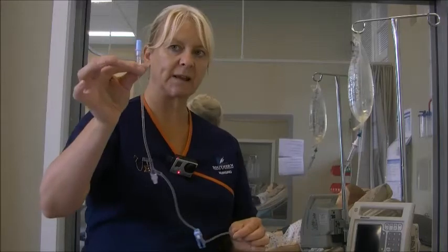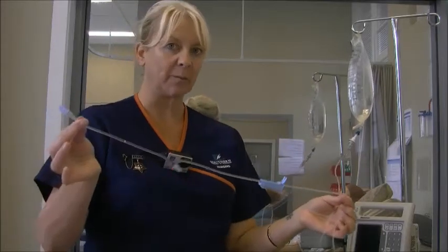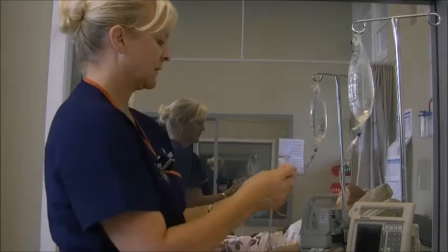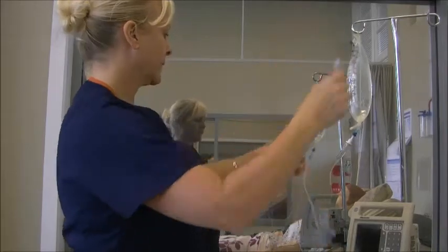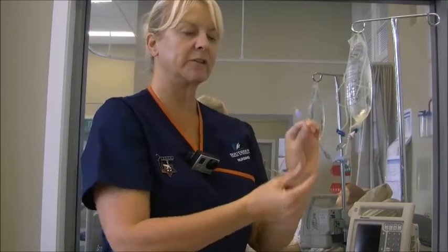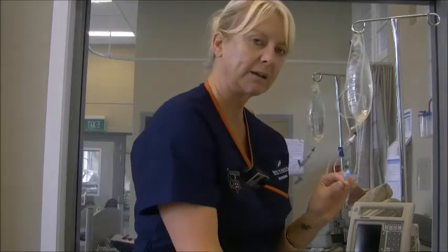Okay, so I haven't dropped any out of the end, and I can see through my tubing, once I check through it, that there's no air bubbles in there, because it's really important that your tubing is clear of air. So I'm just going to connect that up there for a minute. This is the connection. You don't want to take that off, because underneath that is sterile, and you want that to be completely sterile when you connect it to your tubing.